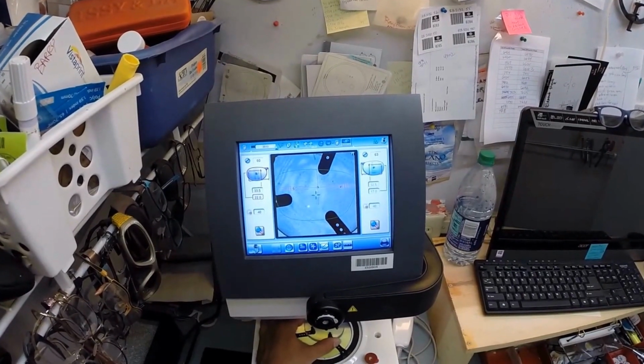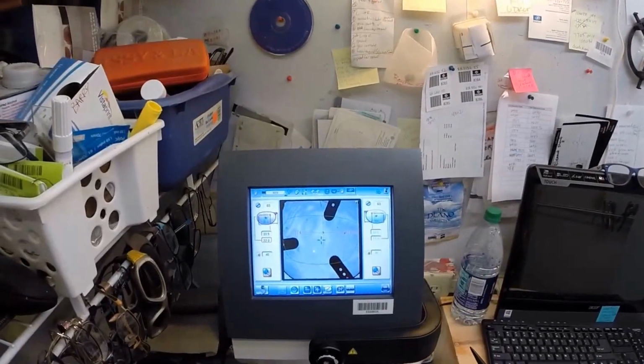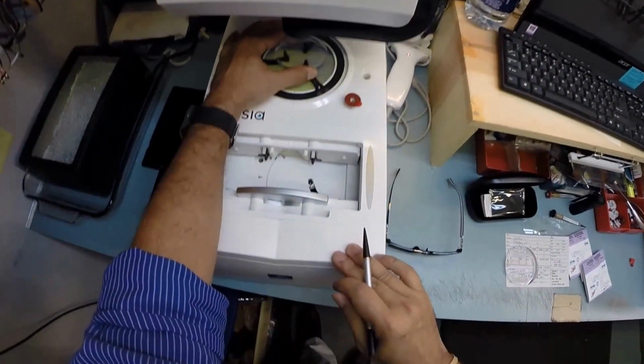Hang on 1 second. And then I hit that button. Make sure everything's lined up perfectly. I apologize, I'm just meticulous. Hit that button and the arm's going to come down and place the block onto your right lens.